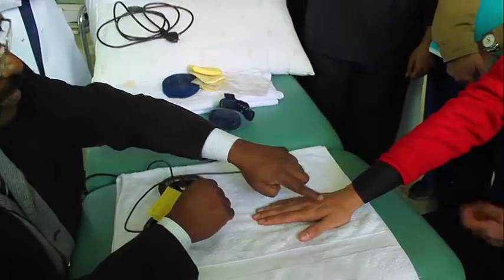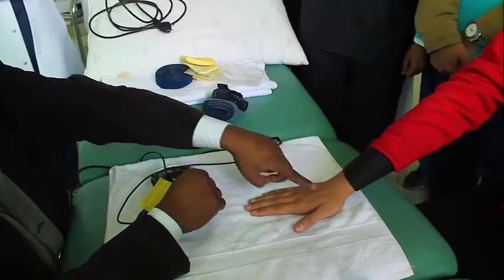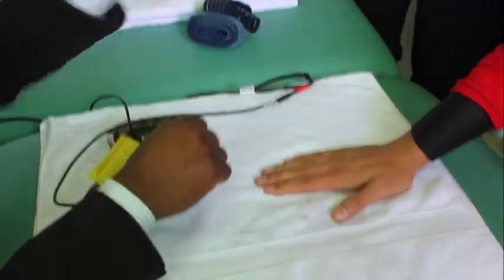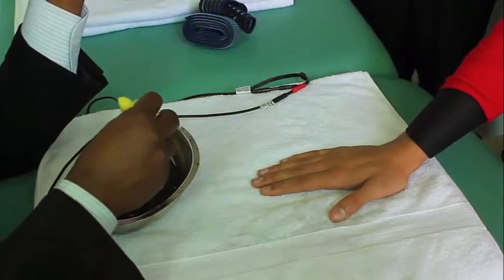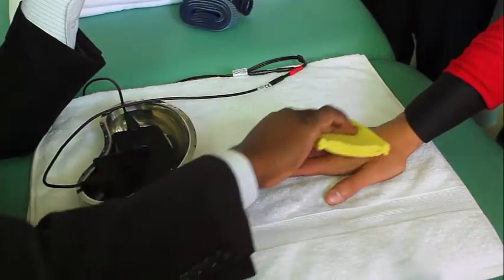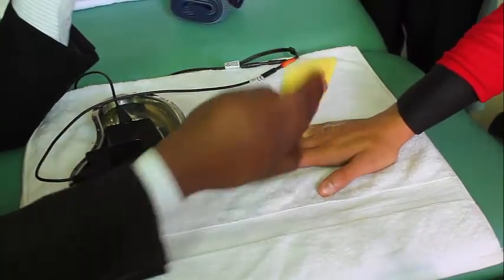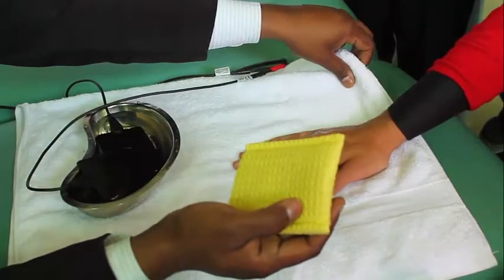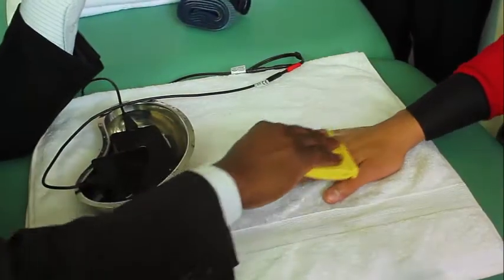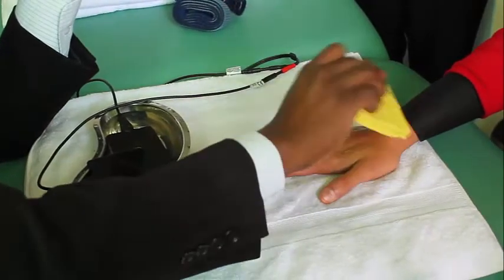Here, this one no problem. Here, any area, for example a ring, that is a problem. Whatever materials are there, you remove. Now, apply the water. Okay? Apply the water as much as possible. Why did I keep a towel down? Because more water goes and is absorbed by the towel. So, apply the water as much as possible.